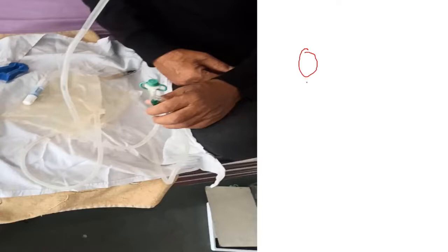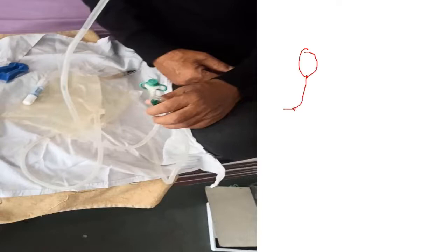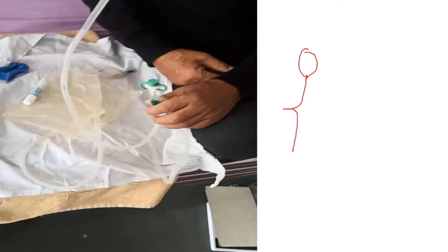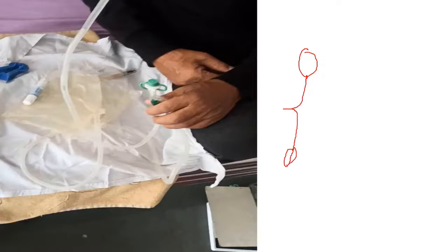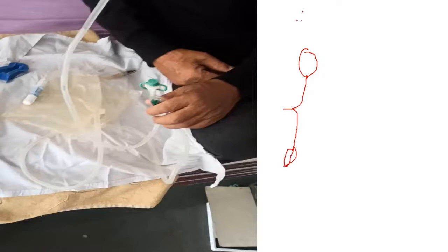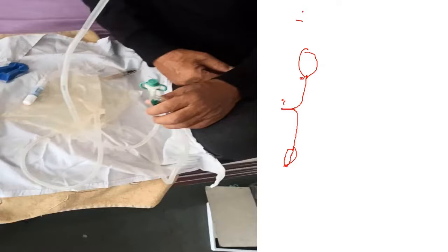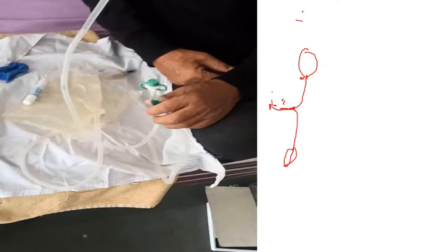Now we will see a video of how the patient connects the PD bag, which comes in a Y-system consisting of a drain bag and a main bag connected with a Y tube. The patient is going to connect it to the transfer set.